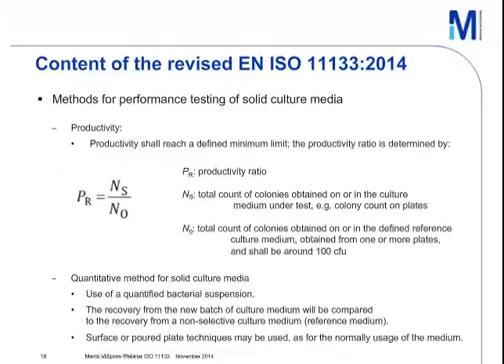For the quantitative methods for solid culture media, a quantified bacterial suspension has to be used. The recovery from the new batch of culture medium will be compared to the recovery from a non-selective culture medium, the reference medium. Surface or poured plate techniques could be used, as in the normal usage of the medium in the routine.